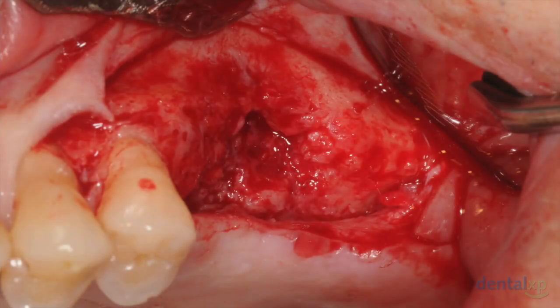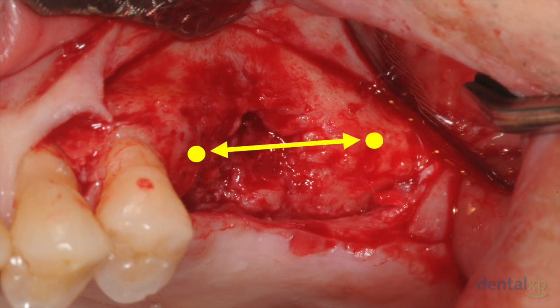So we'll access the site with a crestal incision and a generous flap to access the ridge and the lateral aspect of the maxilla for a conventional sinus lift. And here we see the vertical defect with good bony height at the distal and proximal aspects, creating the described arch form. In preparation for bone harvesting, we'll first measure the length of the desired bony shell.